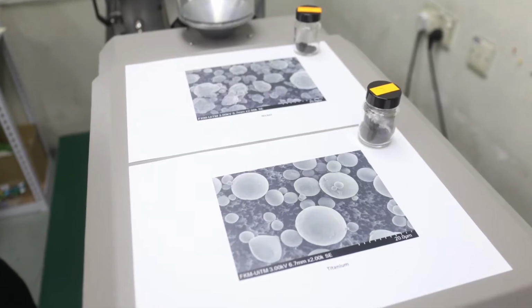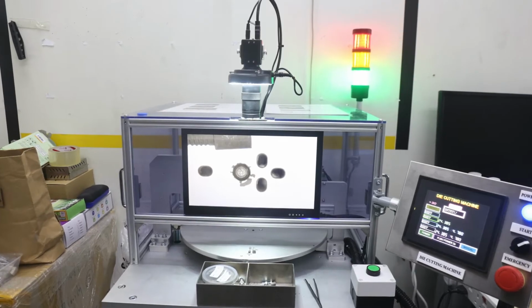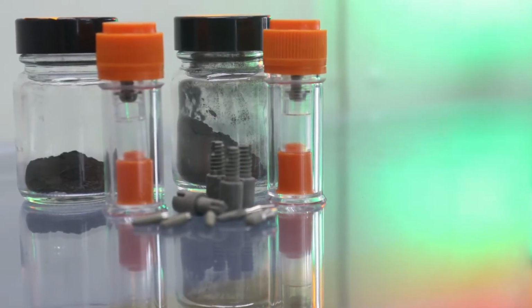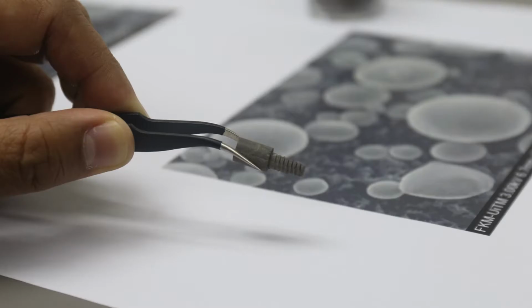This project is about production of porous NiTi by metal injection molding. In this innovation project, the raw materials are nickel and titanium powders, and the process involved is metal injection molding, where the powder that we use is very fine metal powder in the range of 20 to 30 micron in size.